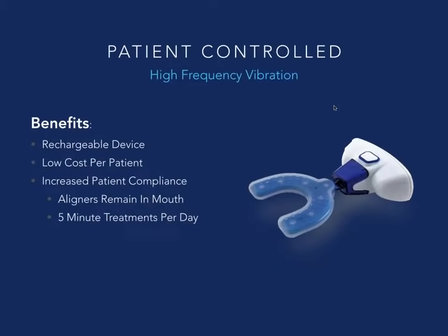First one we'll talk about here is the vPro 5. It's a rechargeable device. It's obviously a patient-controlled device. We're dealing here with something that the patient has total control over, we don't, and it can be a little bit of an issue in the sense that we have to rely on their compliance. But I will tell you, the easier that the device is for the patient to use, obviously the more they're going to use it. And this device is pretty darn easy.